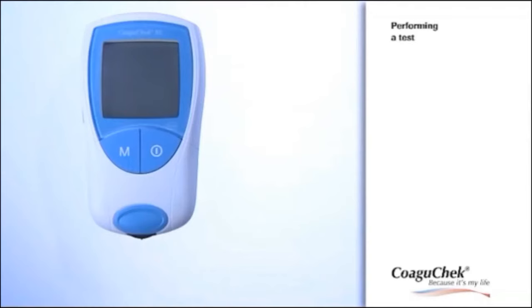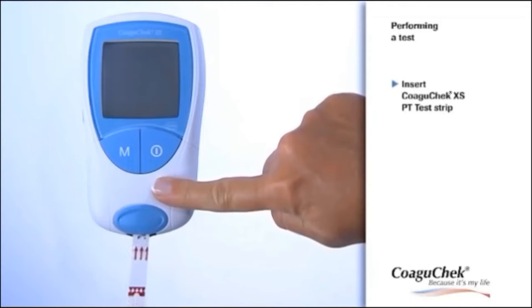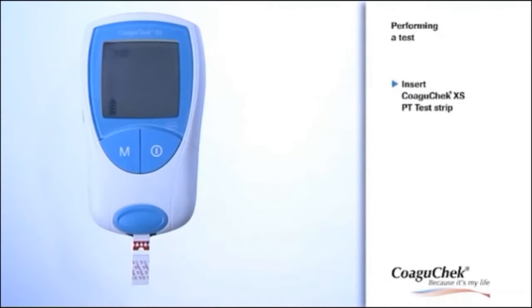Place the meter on a level, vibration-free surface or hold it in your hand so it is roughly horizontal. Insert a test strip and hold it so the labeling is facing upwards. As you will see, the meter turns on automatically. Please remember to close the strip container again.